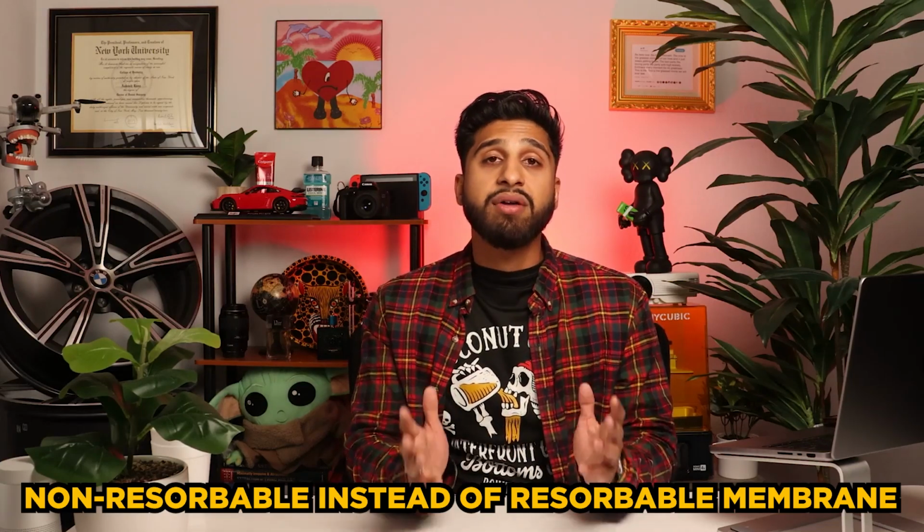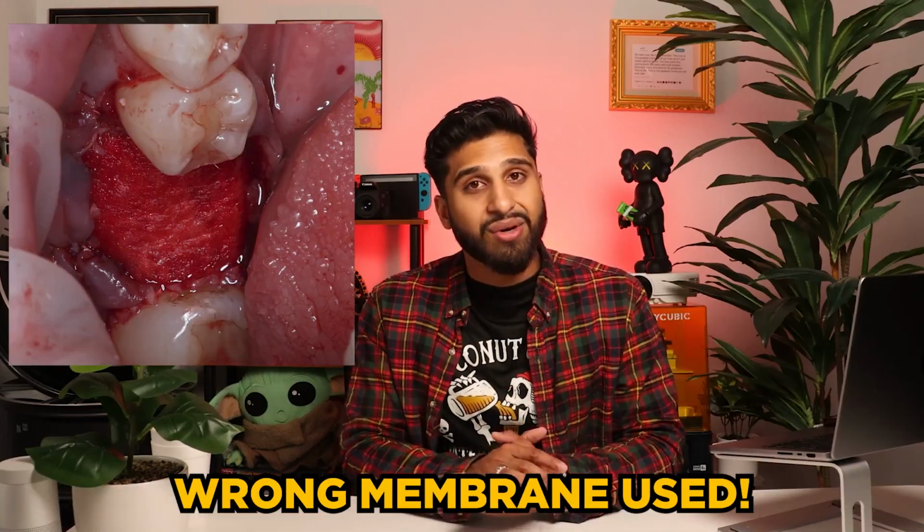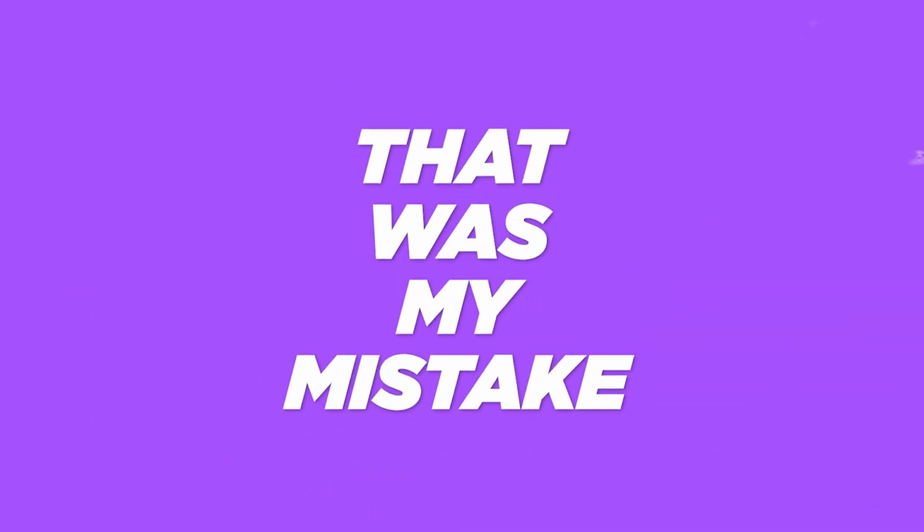She says pack the bone to the level of the crest. Overpacking the bone above the crest will not give you any advantage here, Akash, and the bone above the crest will not be retained. The non-resorbable membrane will be the membrane you leave exposed to the oral environment, not the resorbable one. So that was my mistake we talked about earlier.